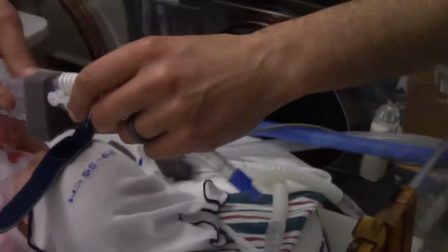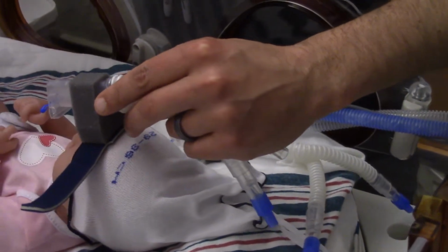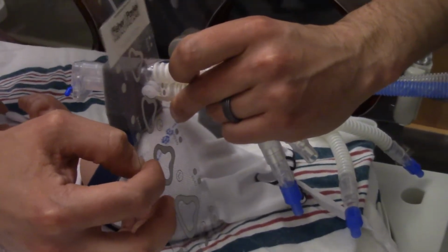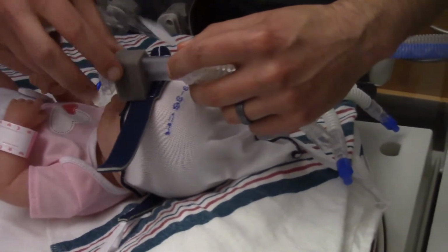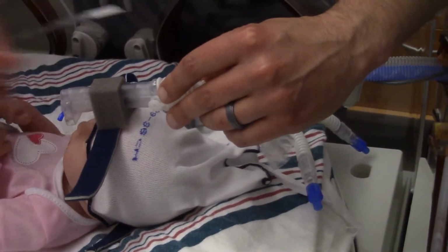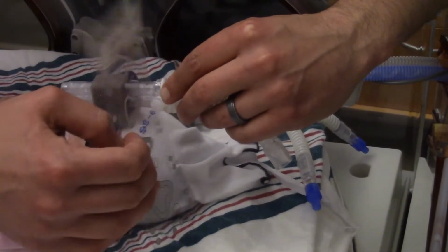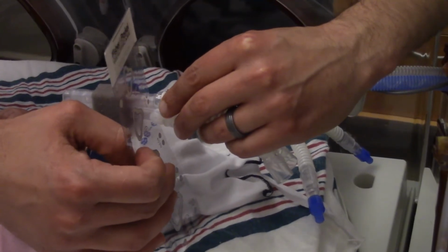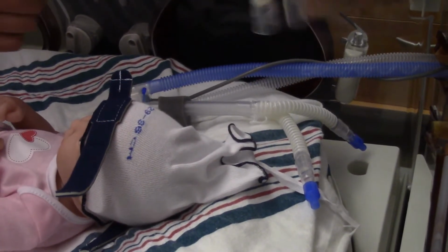The 50 ends well short of the baby's head, top of the head rather. So the 70, we can see, is the Goldilocks for this child, where it ends just about perfect right there. So the 70 would be our choice for this one.